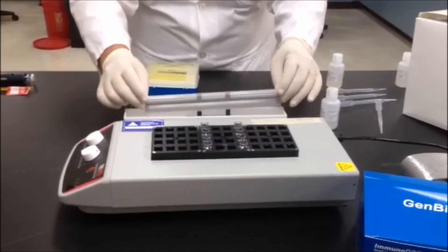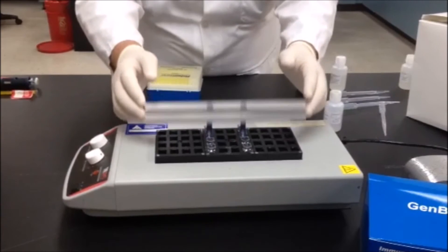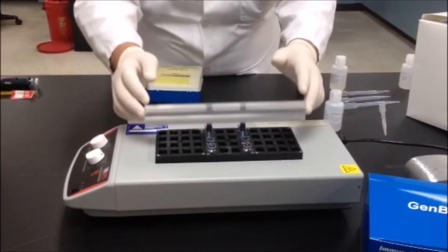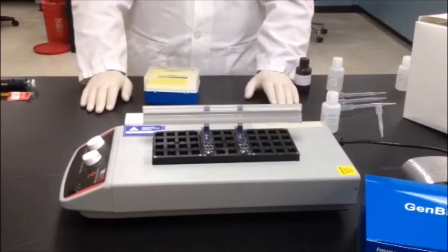Place the reaction strip into the third reaction vessel containing reagent number three, the conjugate, again mixing the reaction with a few quick up and down motions. Incubate in vessel number three as specified in the package insert.